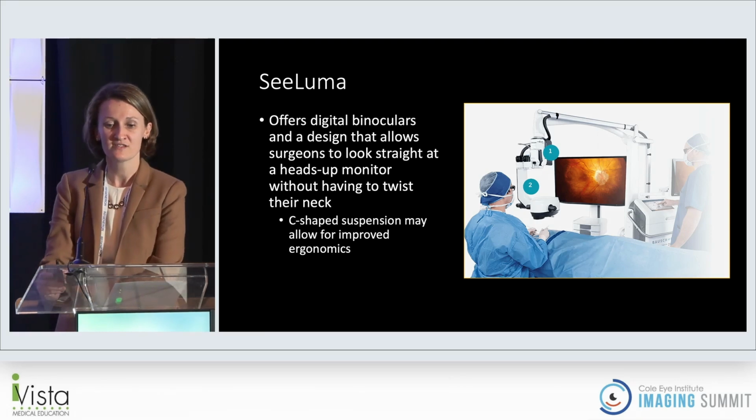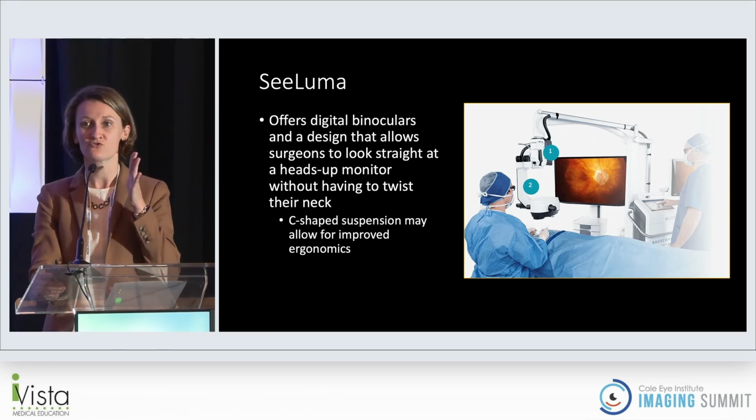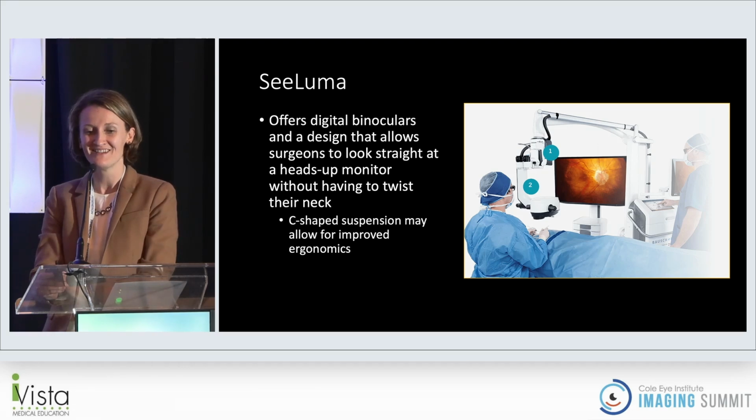And this can be really helpful when you're doing macular work to peel membranes that are present. This is another system that really offers digital binoculars in a design that allows the surgeon to look straight ahead rather than having to look around a tower, which can be really nice for ergonomics as well.